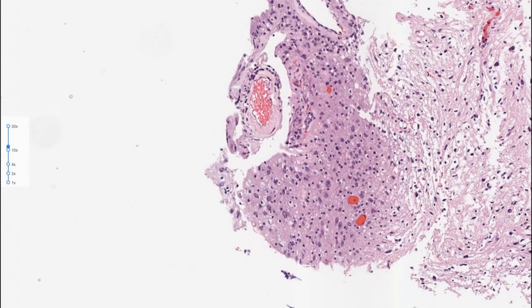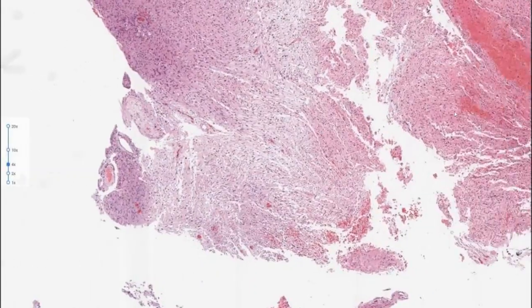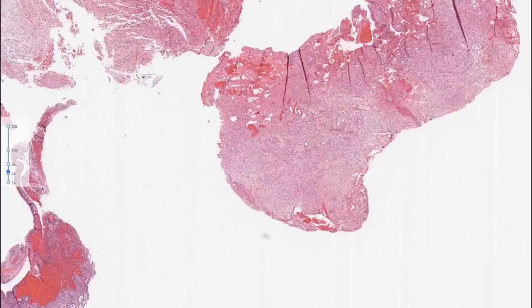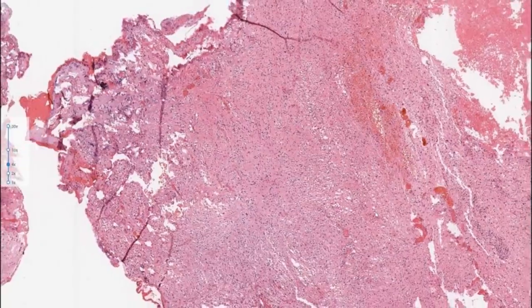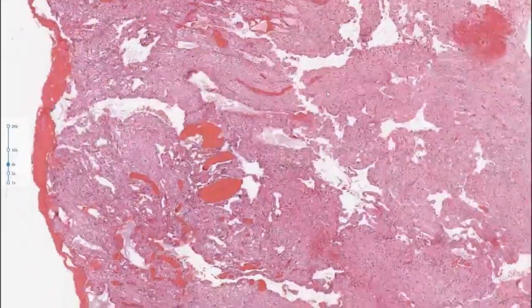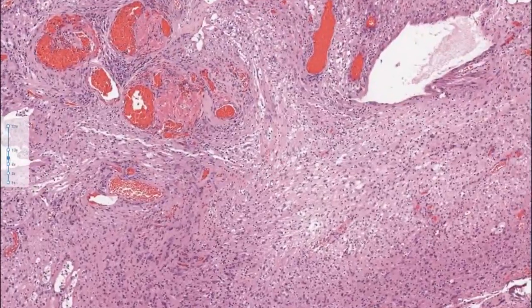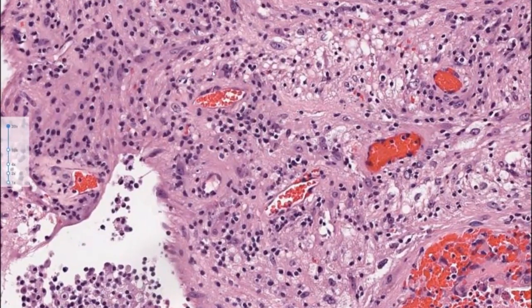Again, you have almost the appearance of a biphasic neoplasm. A bit of nuclear enlargement, not much mitotic activity. Some larger vessels associated with hemorrhage. Collagen. Almost no proliferation. Here you have some of these vessels, and something that is characteristic, frequently they are hyalinized or have thrombosis. Maybe some chronic inflammation.